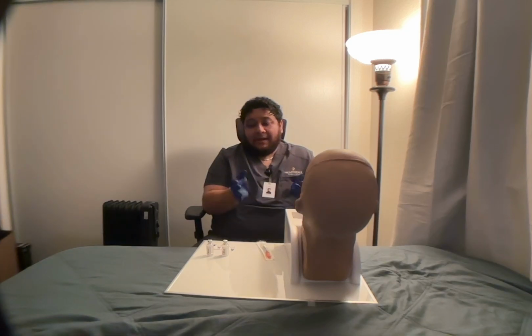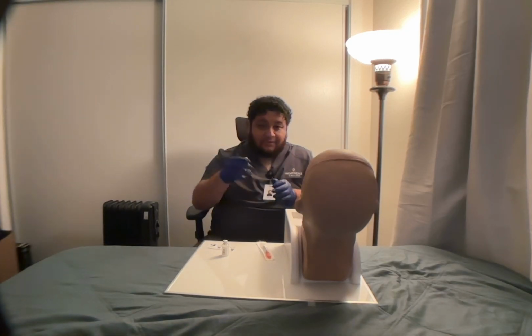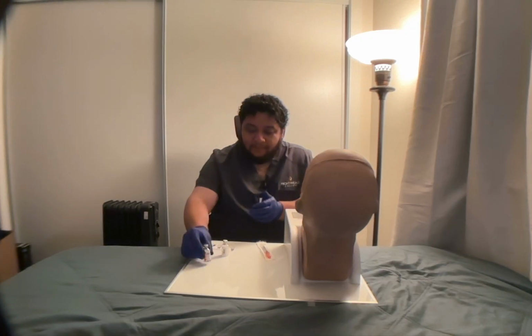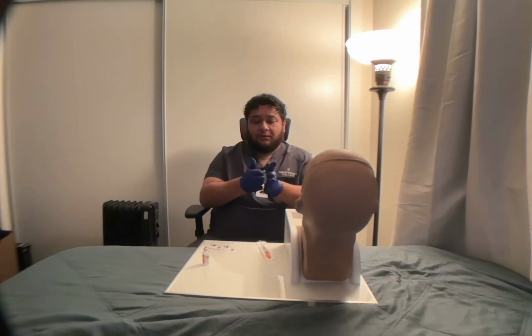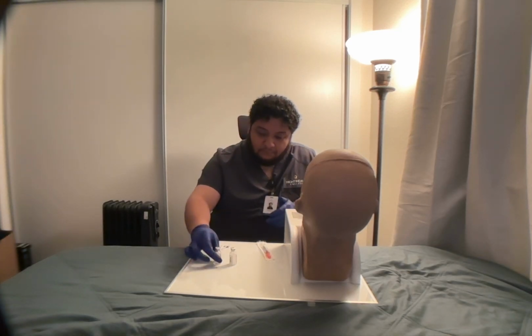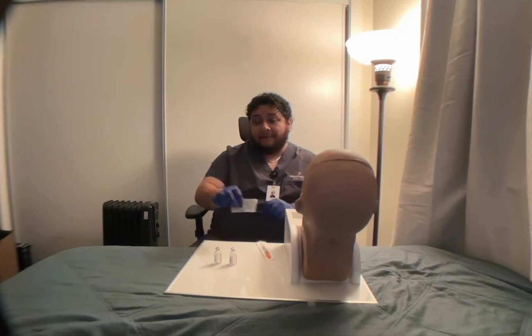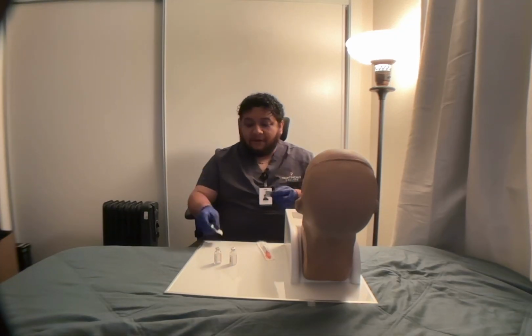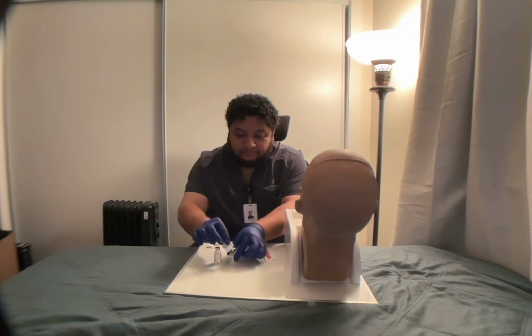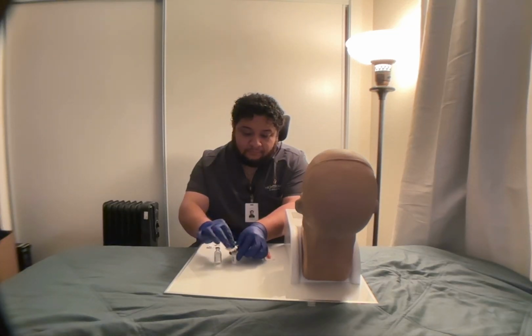I'm going to start by rolling my 2 vials gently with my hands just to warm up the solutions, like so. Now I'm going to clean the tops of the vials with individual alcohol swabs. One use per vial only. Want to clean it pretty good.